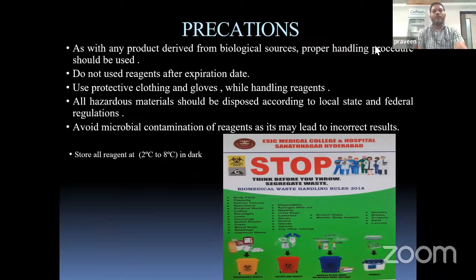All hazardous materials should be disposed of according to local, state, and federal regulations. Avoid microbial contamination of reagents as it may lead to incorrect results. All reagents and antibodies should be stored at 2 to 8 degrees Celsius in the dark.